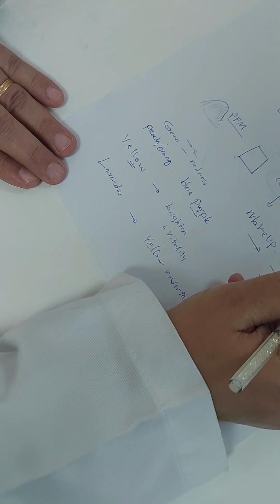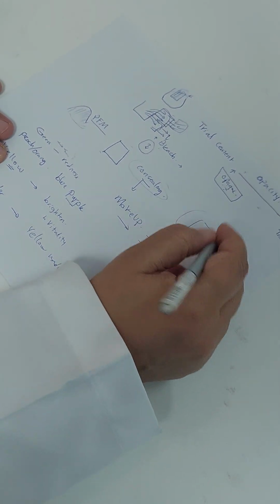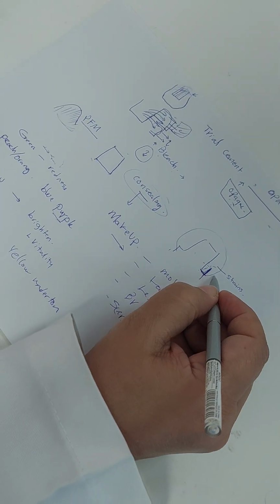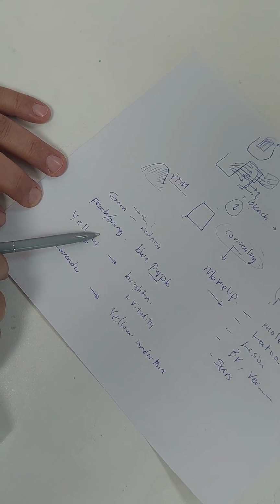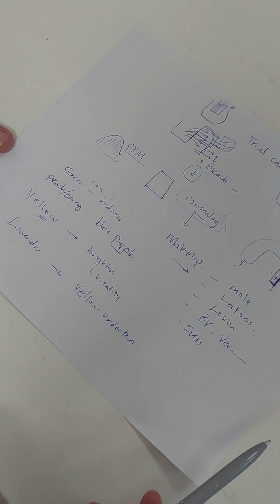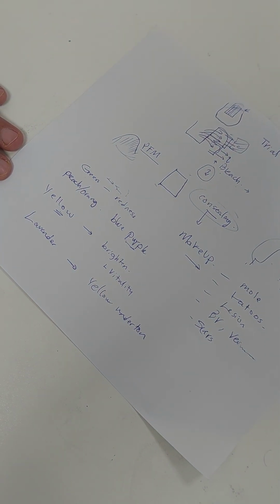So what do you do in this case? Once more, this is a discolored tooth. We're going to remove the caries. We're going to ask the technician to play with the colors, do multiple crown trials with a thin anterior margin, and see what combination of these stains we add to the mixture. This is for handmade crowns, so it's not a pressed ingot. It's a hand-built layering technique. This can also apply if you're going to use zirconia. If it's a monolithic material, you're going to choose some stains that counteract these internal tooth stains.